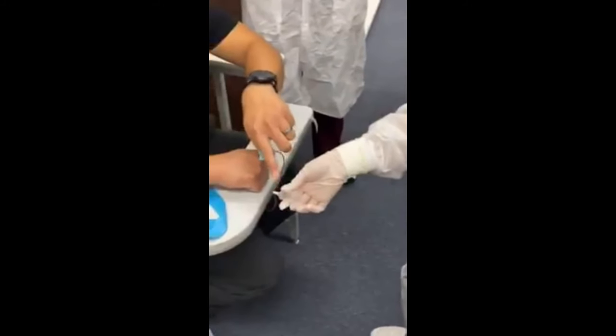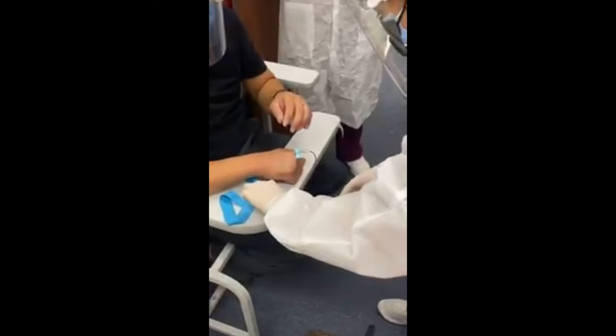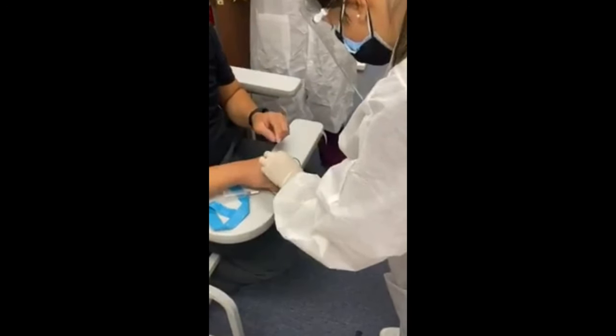And then normally this one, you could just set this aside here. On the side, yeah. There you go. Put this aside, and make sure it doesn't fall. Okay, and then get your gauze, perfect. Then just place it on top, and you could just practice pressing the button for this week.